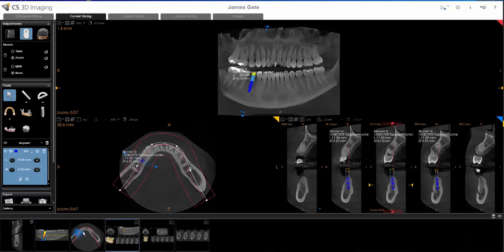If you're accustomed to creating screenshots in your gallery, you can actually drag and drop one of these screenshots into your 2D software. Let me show you how.